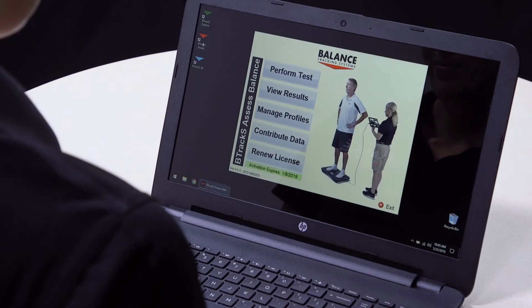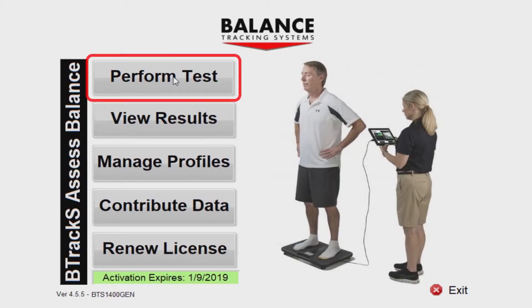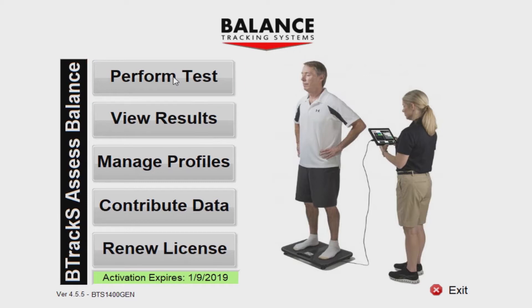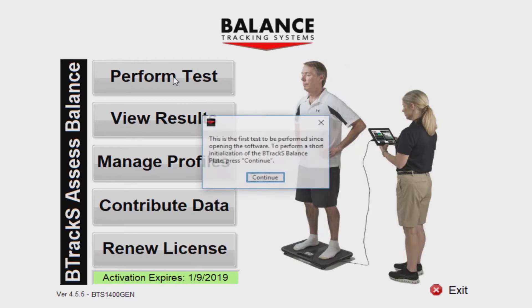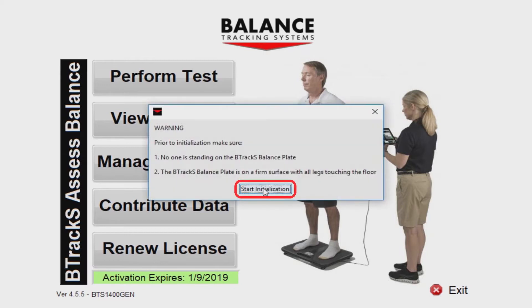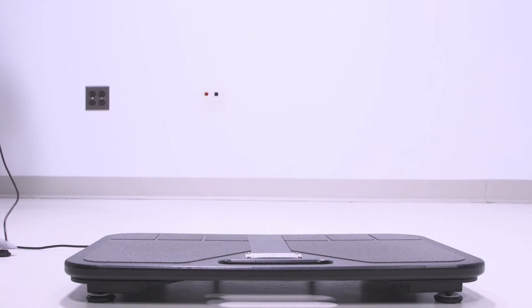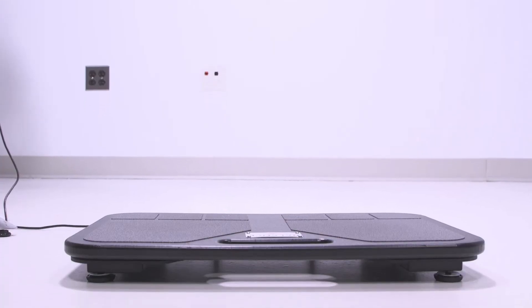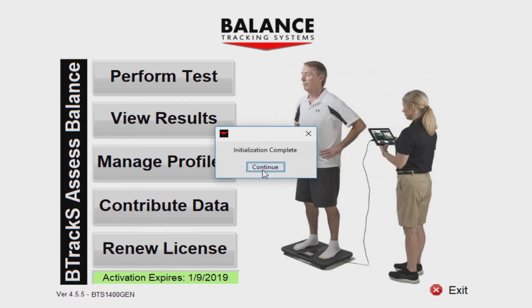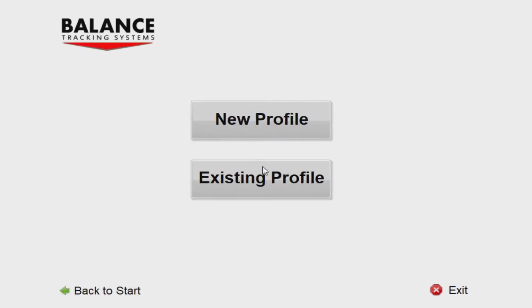On the software home screen, press Perform Test to begin a testing session. Because this is the first time a test has been run since opening the software, a short, five-second initialization of the B-Tracks Balance Plate is necessary. To perform this process, press Continue and Start Initialization. It is important that you make sure nothing is on the plate during the initialization process. Press Continue when initialization is completed.